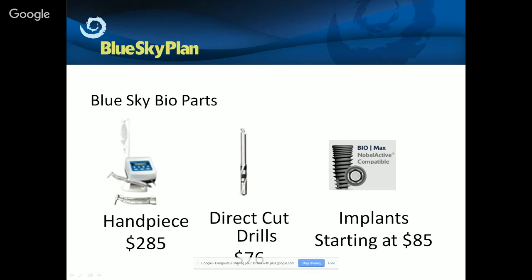There's information on the website about the direct cut drills, about how to use them. There are studies as well. Doctors that have used it have loved it with a lot of positive feedback. It removes the need for handles or spoons. You create the osteotomy size with a single drill, specially designed, and then you place the implant. So it's a streamlined process flow during the surgery itself.